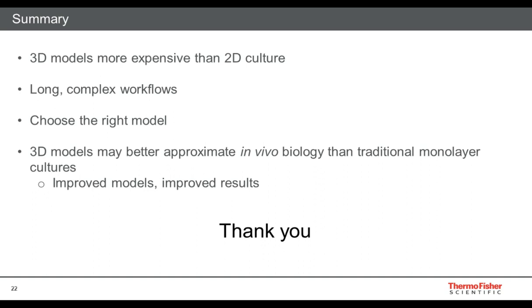Now, Mark, can you expand a little on the challenges and limitations of using matrigel or similar technologies? Sure. As I mentioned during the talk, a number of 3D cell models require the use of an extracellular matrix mimic or mimetic. A lot of these methods were built using a basement membrane extract called matrigel. There are other similar technologies out there. Geltrex and Cultrex are some of the other ones that are useful in making these organoid models in particular, but also some spheroid models.